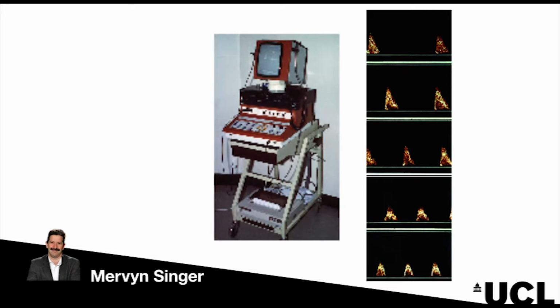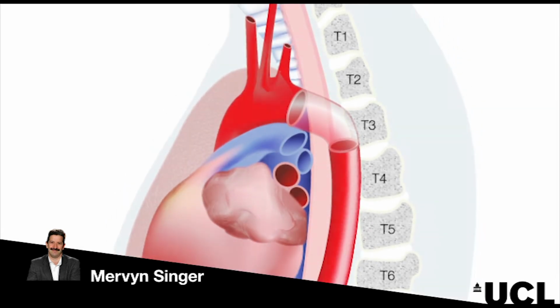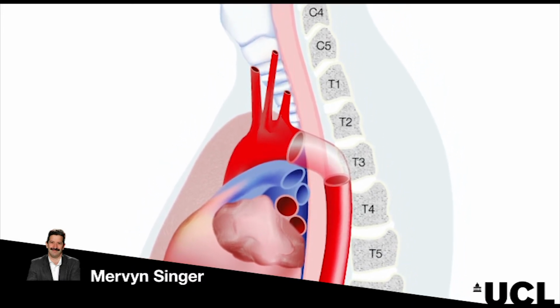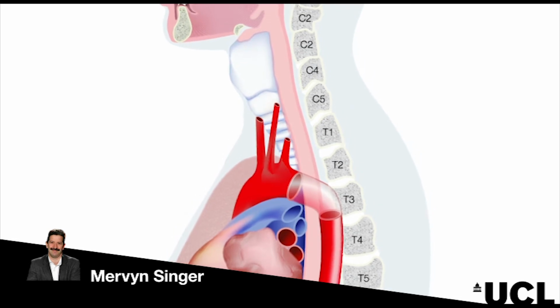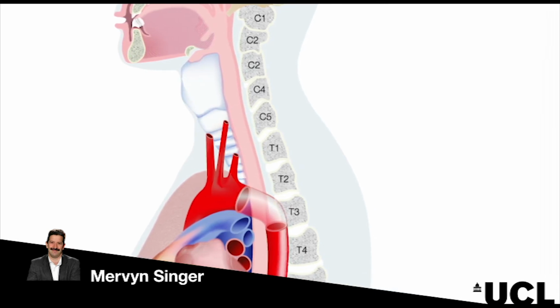The downside with the suprasternal approach was that you couldn't hold it in place, and I tried various gizmos to try and hold it in place to enable continuous monitoring of the circulation. Unfortunately, I failed miserably, and then I had the bright idea of, why don't we put a probe down the esophagus, because my rudimentary anatomy had taught me that the esophagus sat very close to the descending thoracic aorta, and at approximately the third, fourth, fifth thoracic vertebrae, the aorta and the esophagus ran parallel with each other. So in a normal-sized adult, that's about 35 to 40 centimeters from the teeth. The tip of the probe would be in an esophagus that's running in line with the aorta.